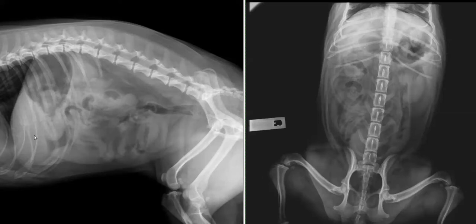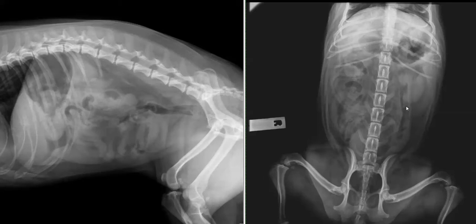After evaluating the liver, I look at the spleen. We can see the tail of the spleen nicely on the lateral in the dog — it has smooth, regular, triangular margins. Don't forget the head of the spleen, which lives up here, caudal to the stomach. On the VD projection, we can see the spleen running down the left abdominal wall, and it still has that smooth, strap-like shape with sharp margins, with the head being closely attached to the stomach.